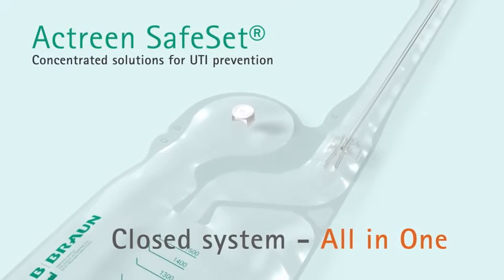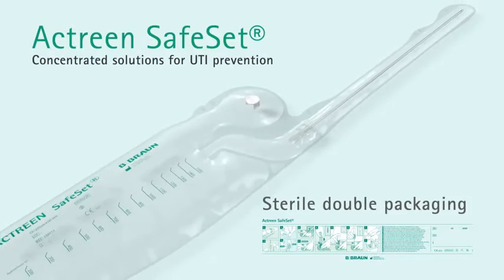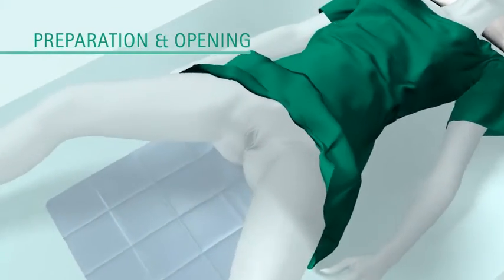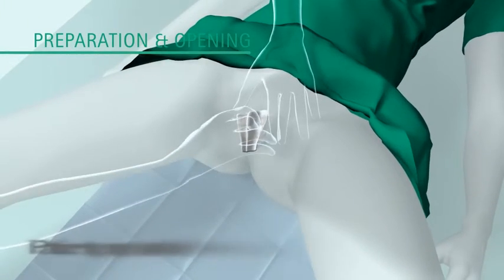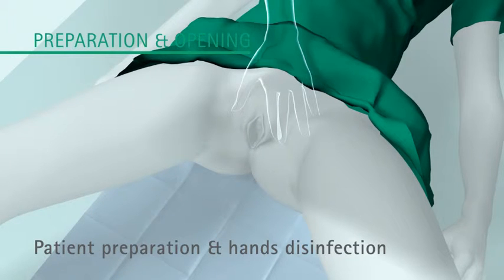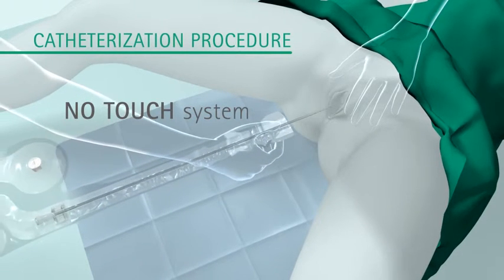Actrine Safe Set is an all-in-one product in sterile double packaging, low profile and lightweight. How to use Actrine Safe Set: prepare the patient for catheterisation and clean your hands according to your protocols. Open the sterile double packaging, tear the catheter tip and start the introduction into the urethra using the no-touch system.